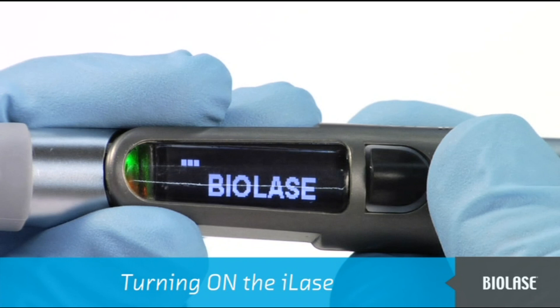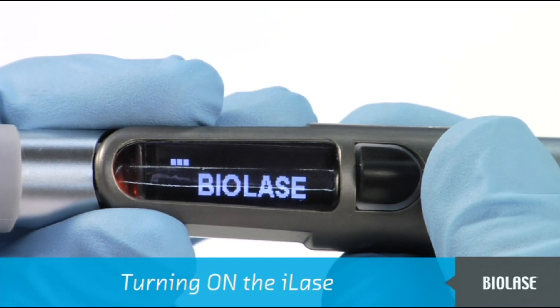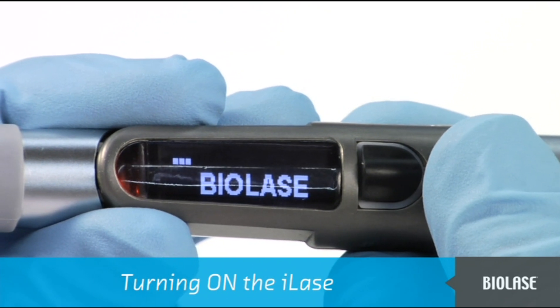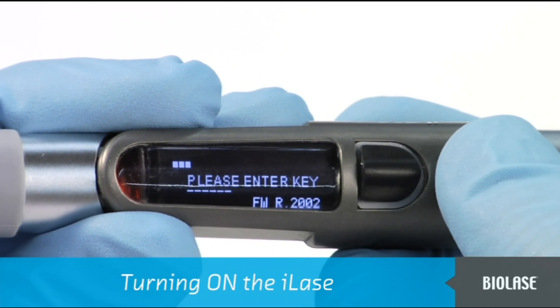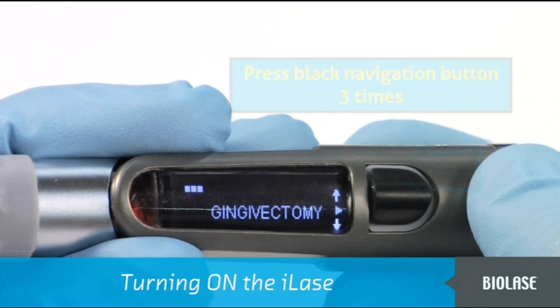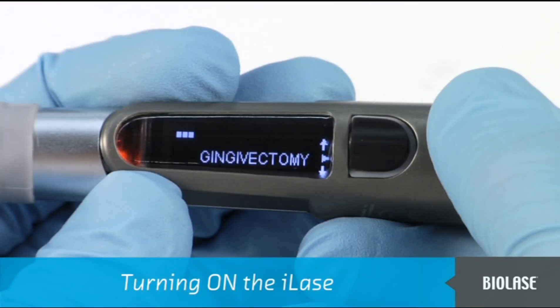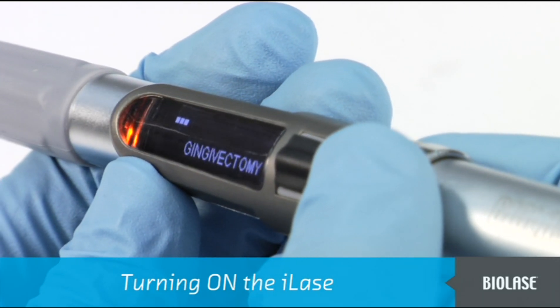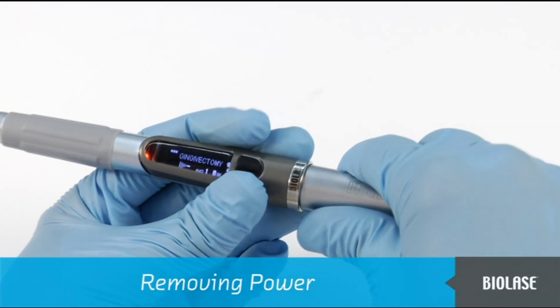You will be asked to enter a key code to unlock the system. If you do not enter the key in time, the system will return to the BioLaze screen. To return to the Enter Key screen, simply press the navigation button in once. When you see the screen asking you to enter a key, press in the black navigation button three times quickly. After successfully entering the key, the iLaze will ask you to select a procedure. Note that the LED is orange, meaning the iLaze is in standby mode and the laser cannot be activated yet. To remove power from the iLaze, simply pull the battery out — this also serves as an emergency stop function.